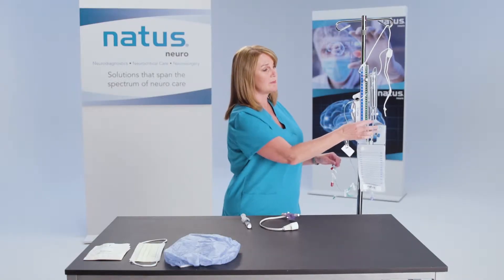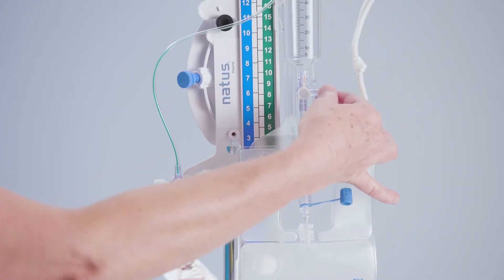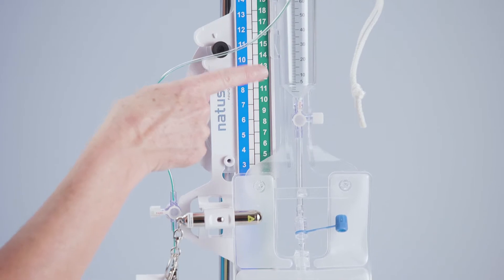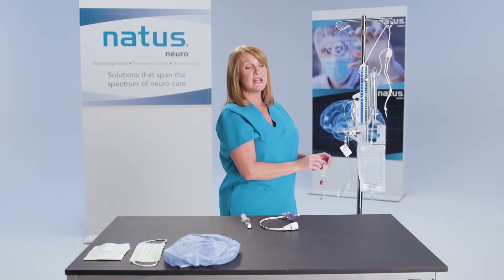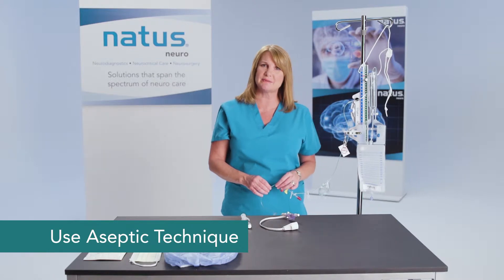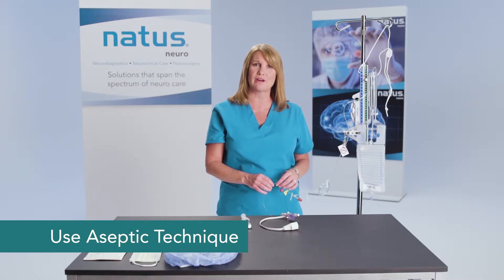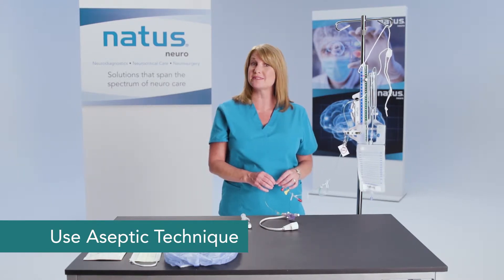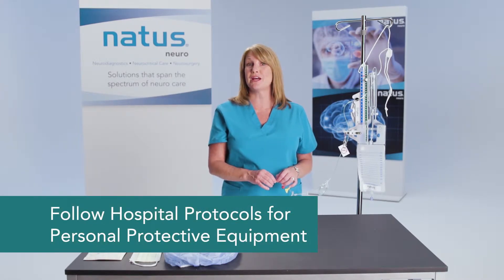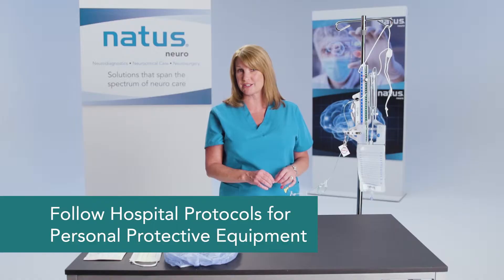I also want to check my fitting at the base of the burette and make sure that my stopcock is off to the burette. This is a good time to remind you that we really want to use aseptic technique when setting up our external transducers and priming the system. You'll want to follow your hospital protocols and make sure that you have your appropriate personal protective equipment, including sterile gloves, available.